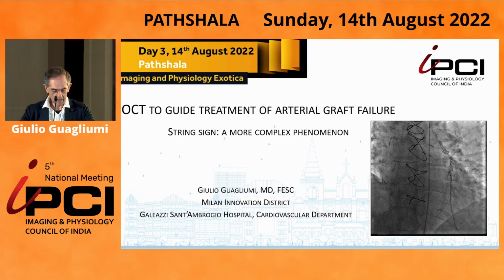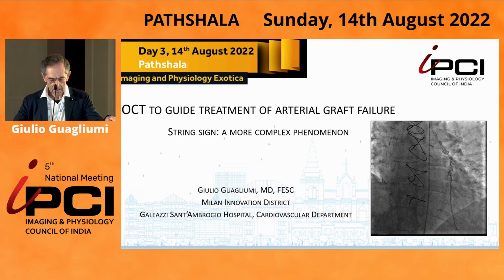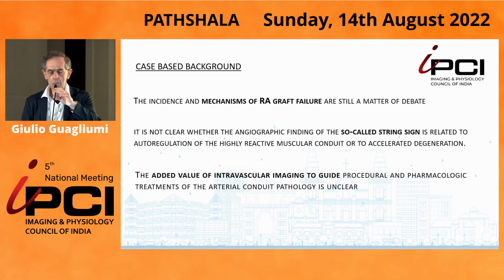The case has a title, and the title is telling you the subject. We are going to talk about arterial graft failure and what people normally call the benign string sign, that in fact could be a more complex phenomenon.